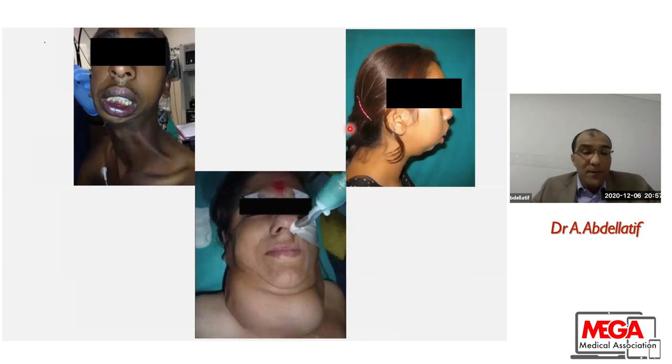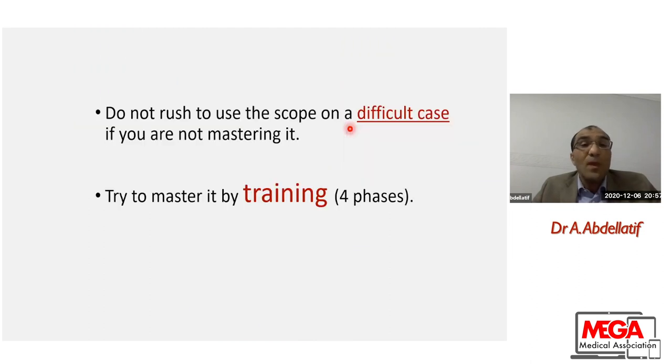So after getting familiar with the device and having good training on a mannequin, when I come to the list, I don't like to choose one of these patients to start my first GA with fiber optic. Do not rush to use the scope on a difficult case if you are not mastering it.